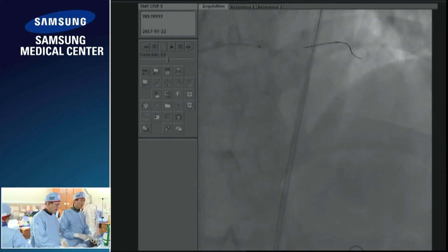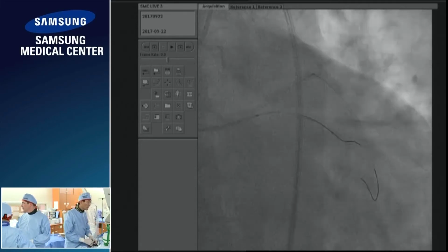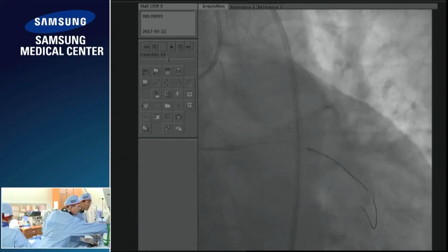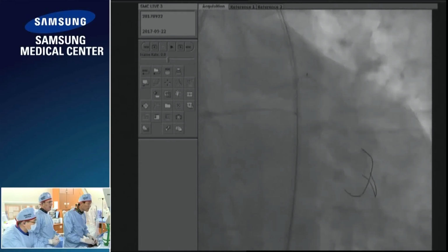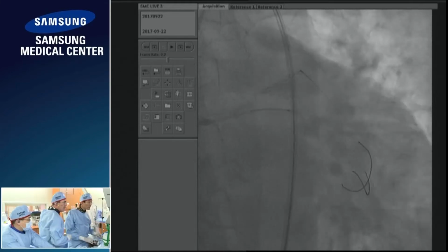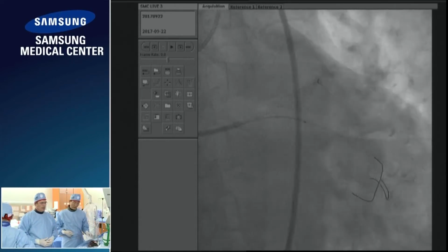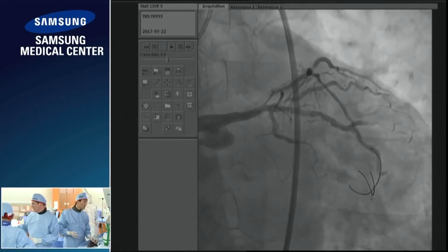Still obscuring the mechanism. With a larger balloon, it's difficult to know the mechanism actually. Just make sure your guide is properly in and your wire is out. Your wire needs to come out a bit of the marginal. Okay. And anyway, just test that the guide is in properly. Okay, so you should get good opacification there. Ready? Okay. Good injection, please. Shoot. Go. There we are.